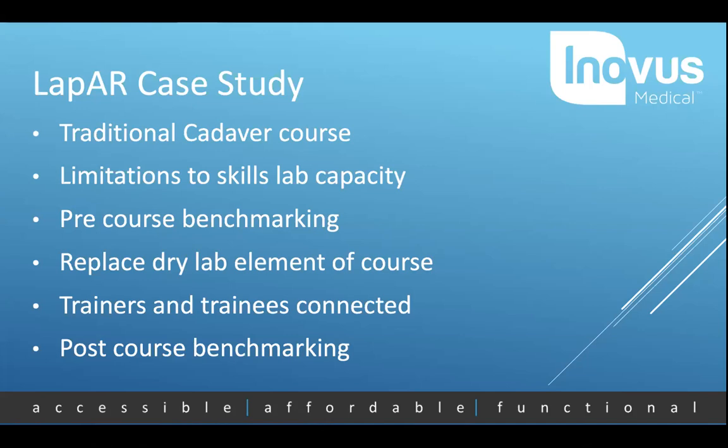And then the faculty and delegates connected with each other. The faculty then set each of the delegates an agreed number of tasks. And in this case, it was 5 of each of our basic LapPass tasks and 5 of our general surgery tasks, because in this case, it was a general surgery course that they were doing. And they set all of those tasks for the trainees. And at the same time, to Conrad's point, they asked them on the fifth go of each of these to record and send a video for review.